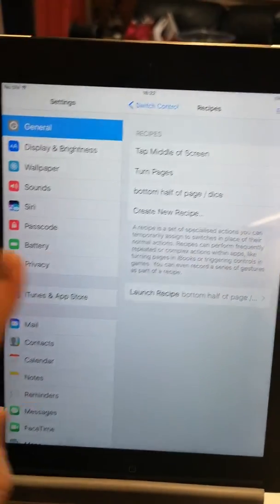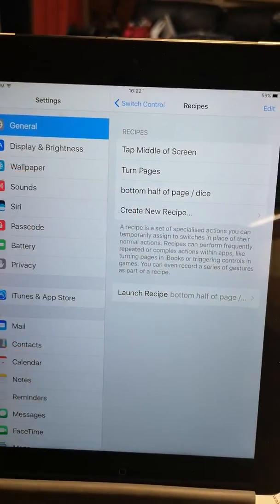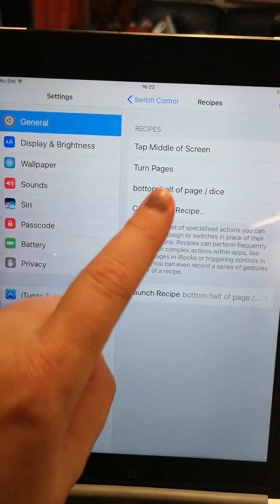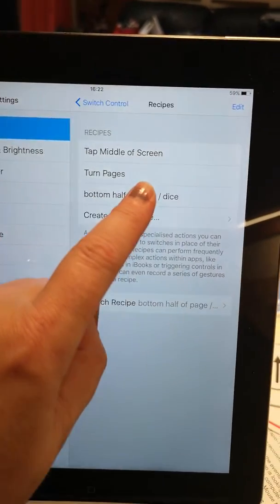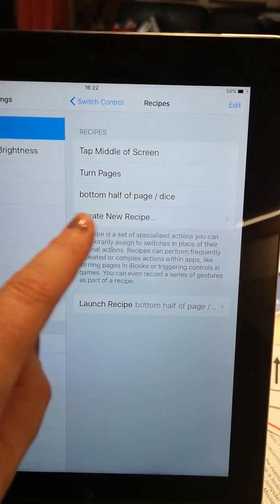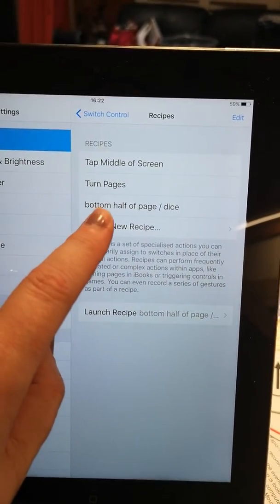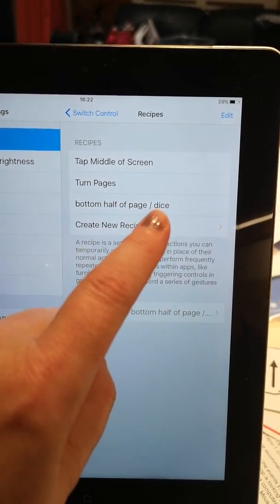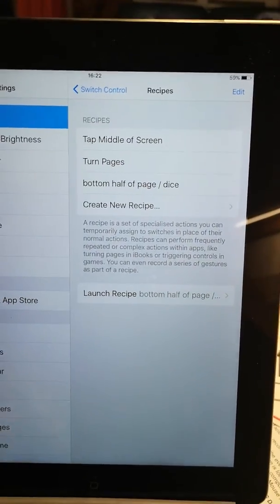a swipe left or right. You can choose that inside there. But I wanted to tap the bottom half of a page. So I already set that up.